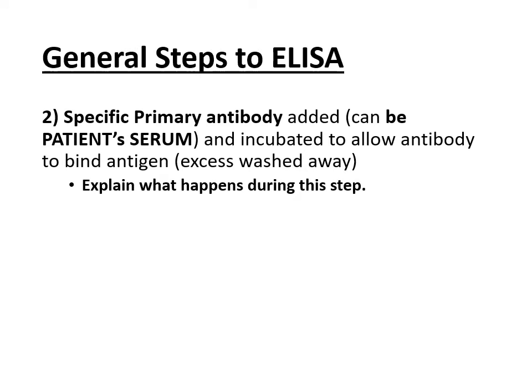The second step is what we technically call the primary antibody. But what it will actually be in the actual experiment is your patient's serum. So you would take your patient sample now and put it into those wells where you had just added antigen.